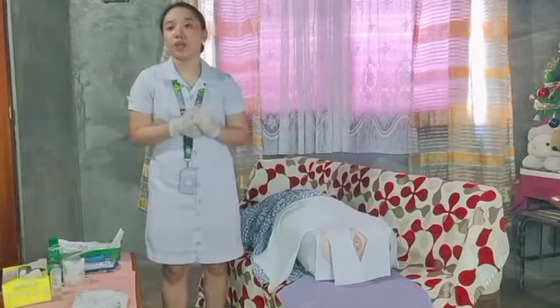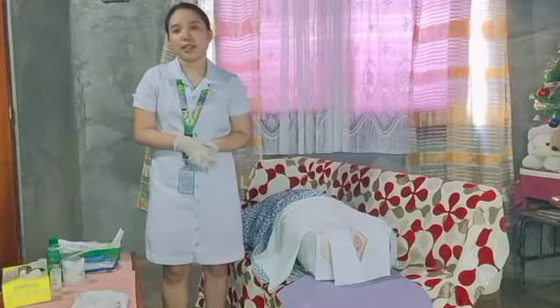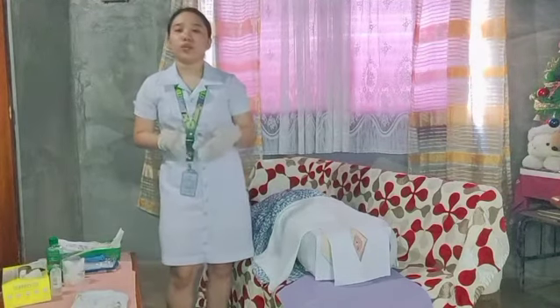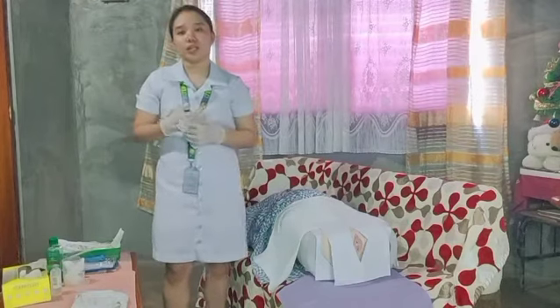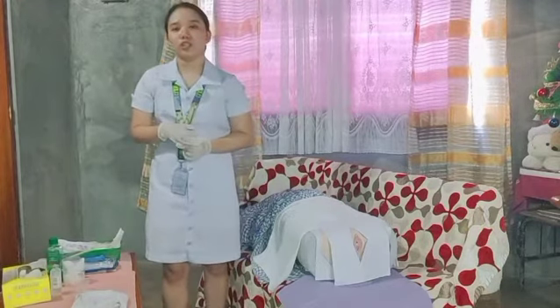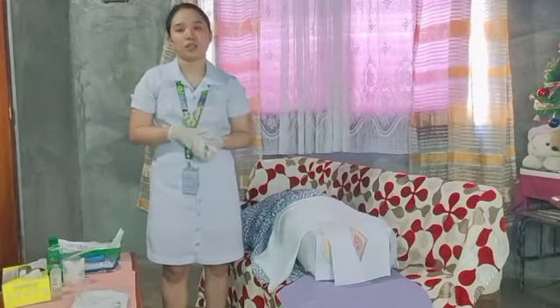Okay, now we are going to gather supplies within reach. The rationale: preparation ahead of time enhances patient comfort and safety, and it also minimizes time and effort. So now we are going to check for the size and type of catheter and use the smallest size of catheter possible. The rationale: larger catheter size increases the risk of urethral trauma, so choose the smallest catheter size possible.